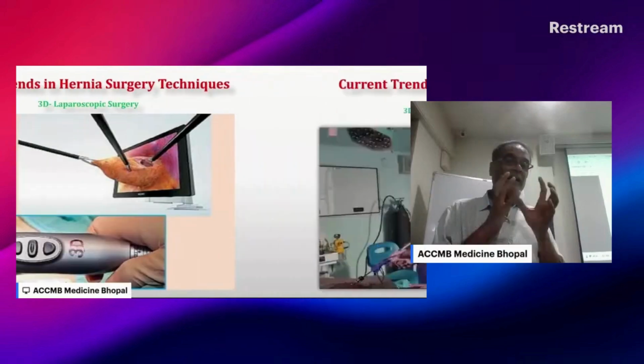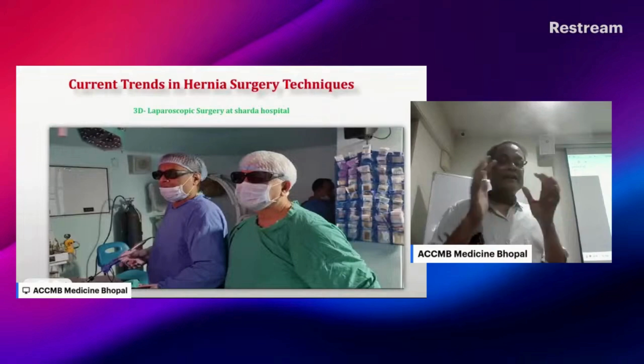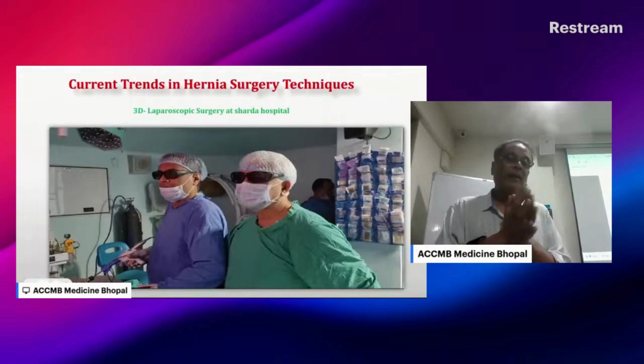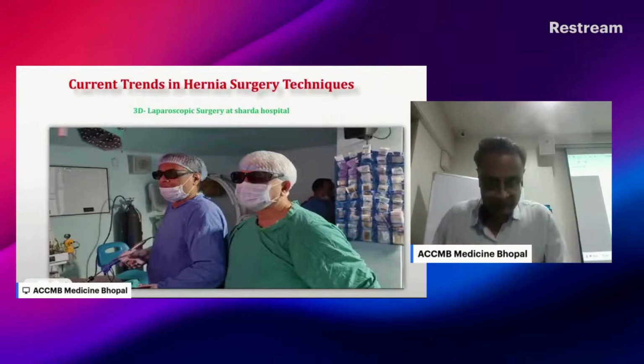Here the camera is very important, because in the telescope we have two cameras at the tip, and both the cameras work on stereoscopic vision. So they give us the knowledge of depth during laparoscopic surgery.